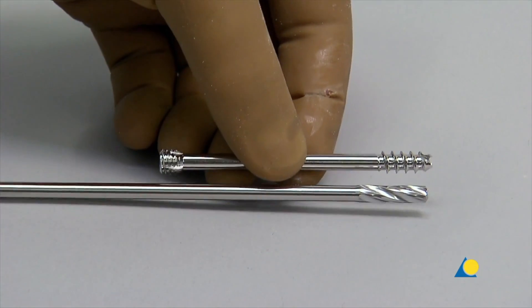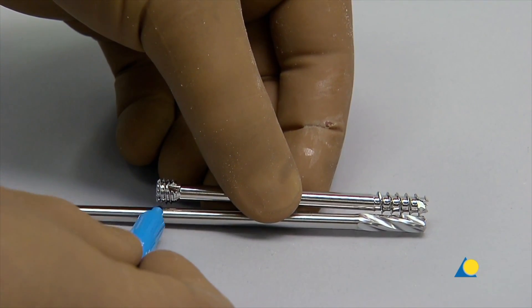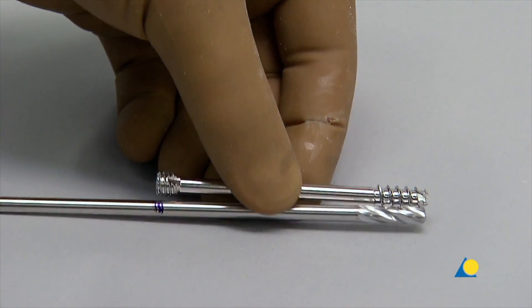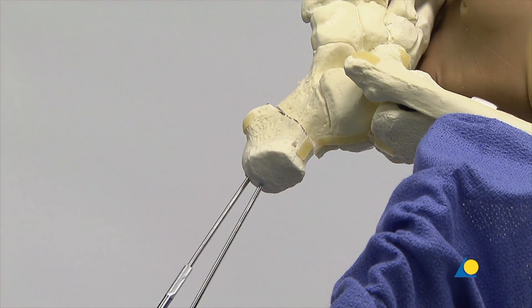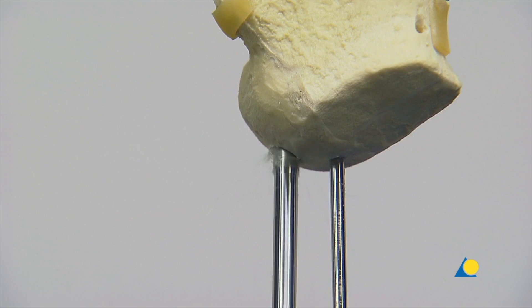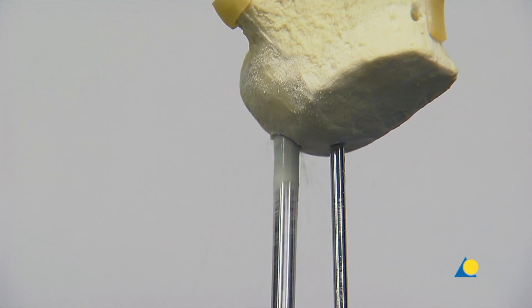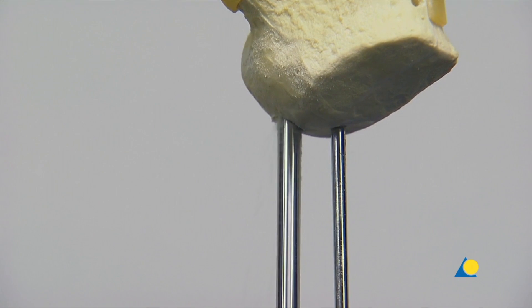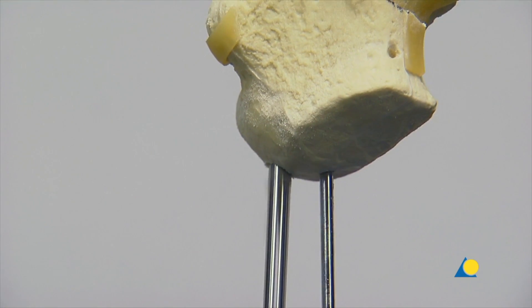The screw length is marked on the 5 mm cannulated drill bit as a reference to avoid drilling too deeply. In practice, the image intensifier is used to check the drill depth. The 5 mm drill bit is slid over the guide wire and a hole is made to the appropriate depth. It should be noted that over-drilling may not be necessary in cancellous bone, as the self-tapping screw will advance easily.